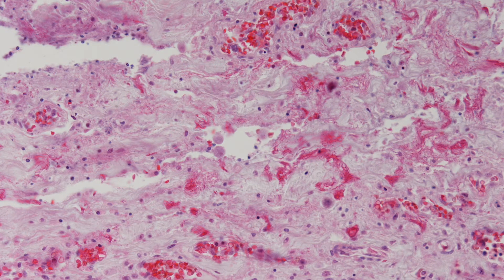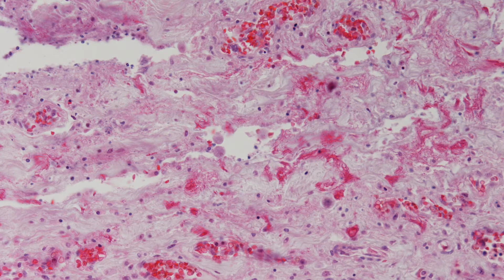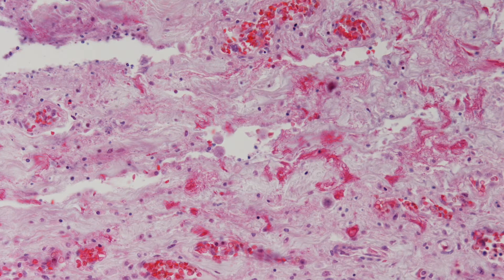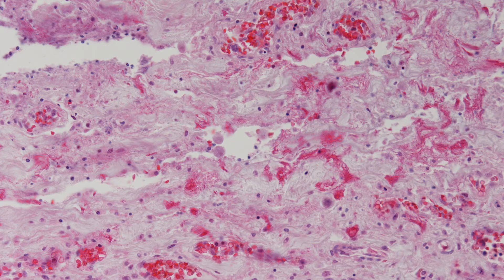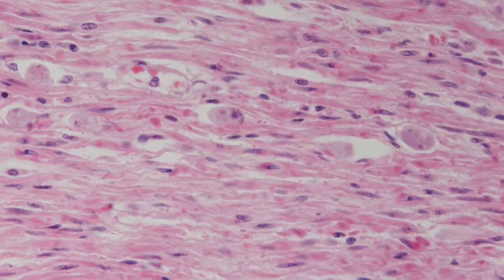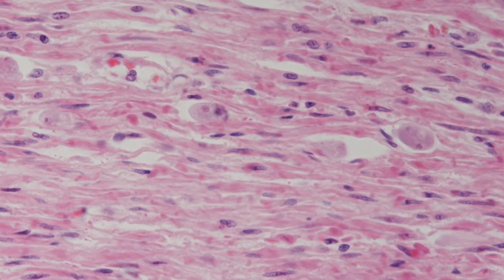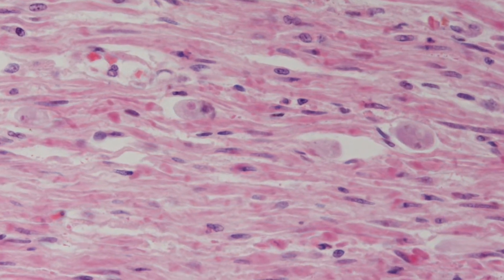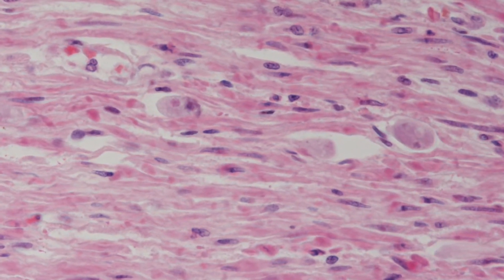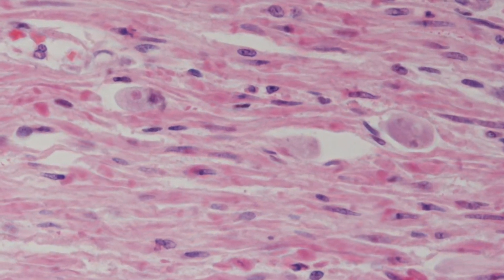Sometimes amoebae can invade the bowel wall, and here you can see amoebae present within the bowel wall. Again, they are the pale staining cells resembling histocytes with eccentric nuclei.